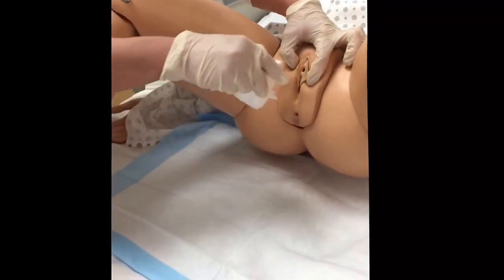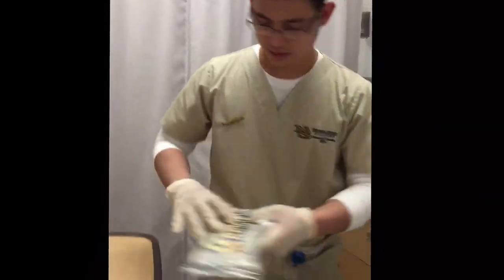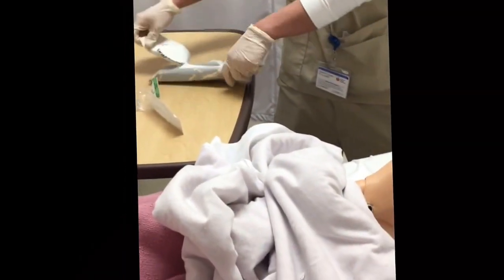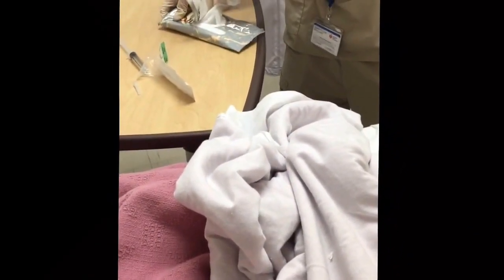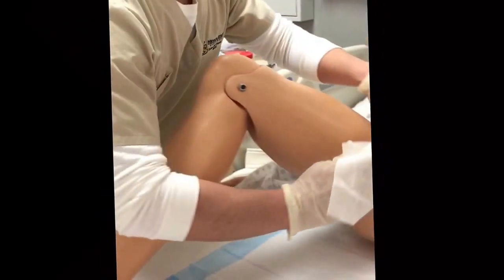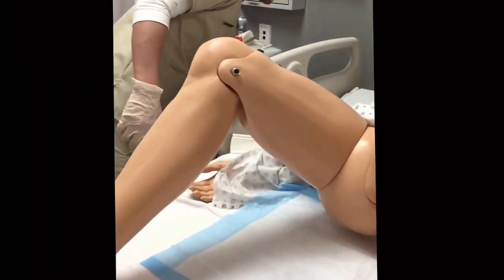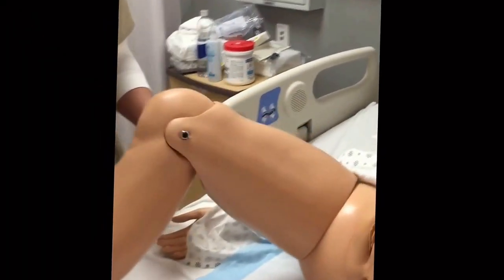Just the other side and just wipe this side. And after that, make sure that you're using the perineal care. That's good for your patient, okay? Maybe just one more on the side. Just make sure that you go. Alright? Now, Miss Susan, you can relax. You can put your feet down, okay?